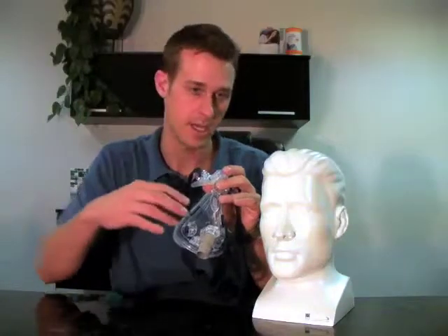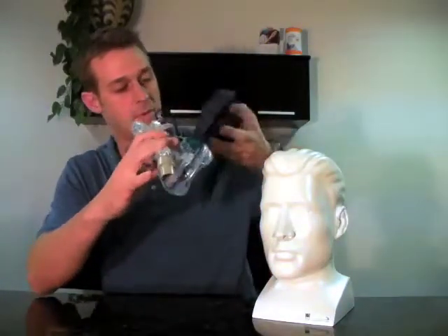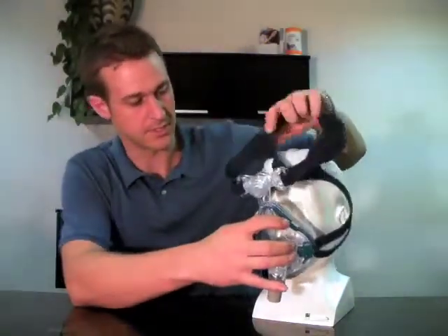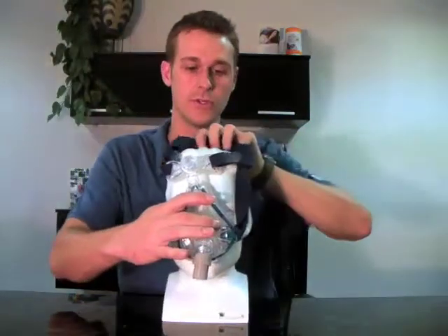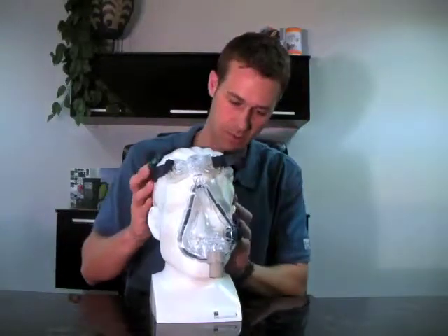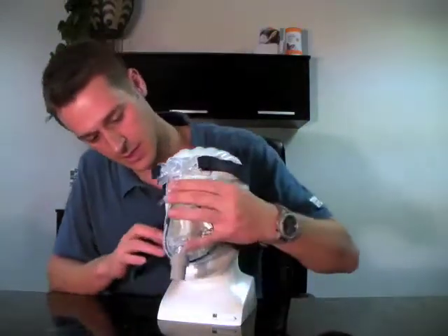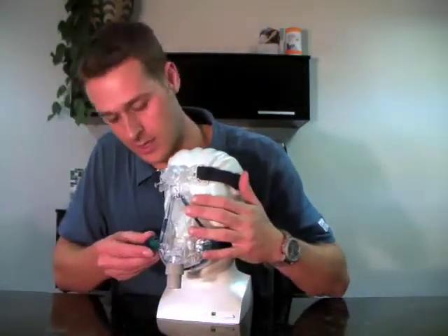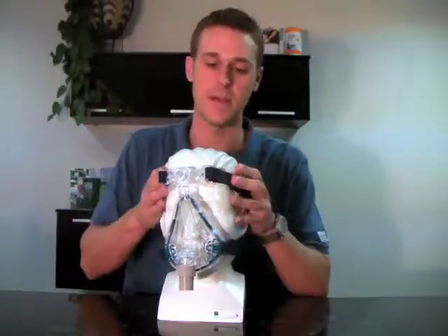I'm going to leave this unclicked so that I can actually put the mask on to John. Typically we would want to put the mask on by starting at the bottom and slipping the headgear over the top of his head. You want to be careful to make sure that the mask is fit snugly but not too tight, and then you snap the side in.